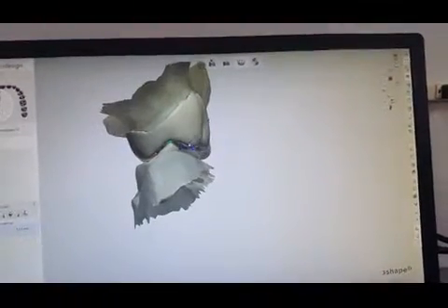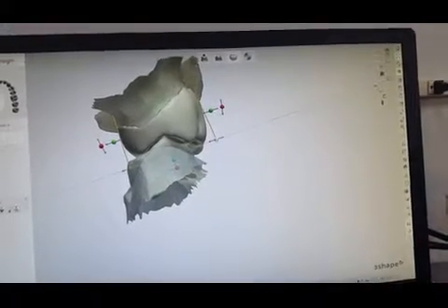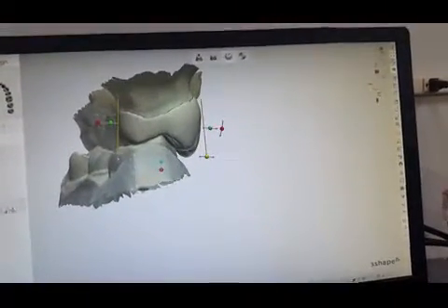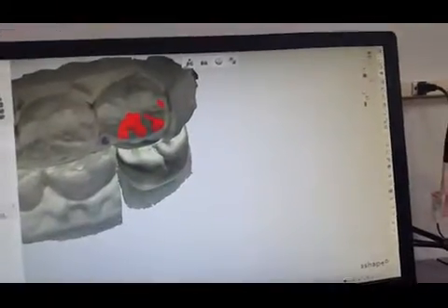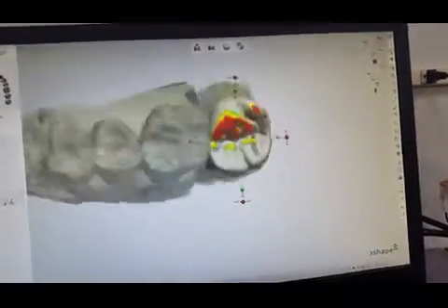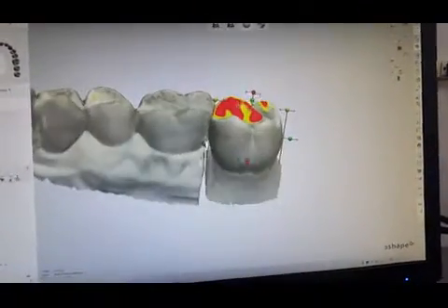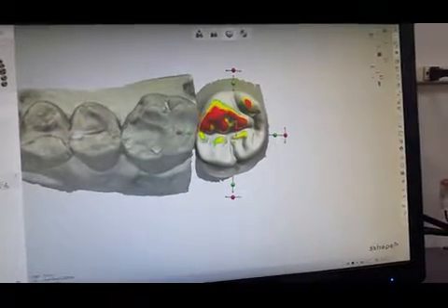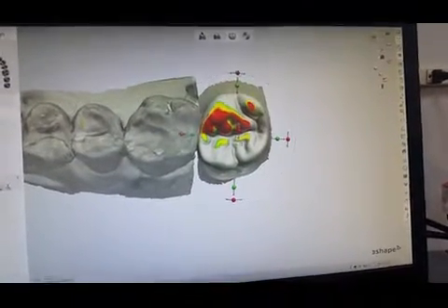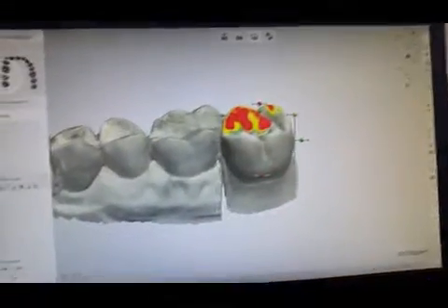I would like to bring those cusp tips a little out, as such. Bring this side just a little bit in. And we have heavy contact here, which I can fix, but initially we have to have the crown in the proper position first, then we can work on the other stuff.